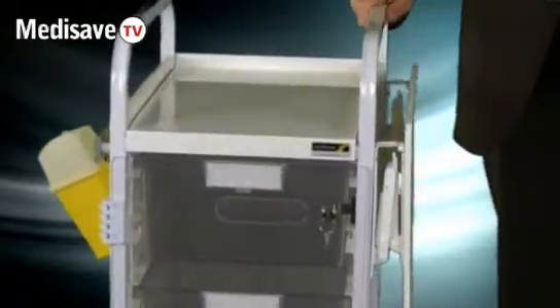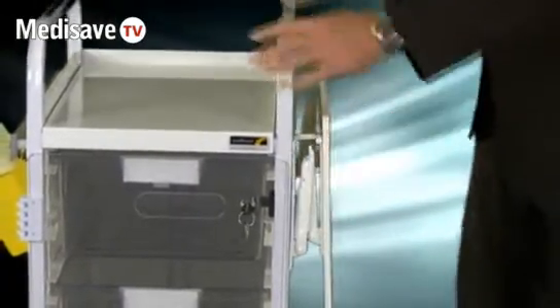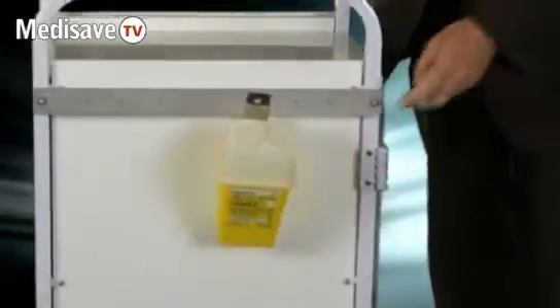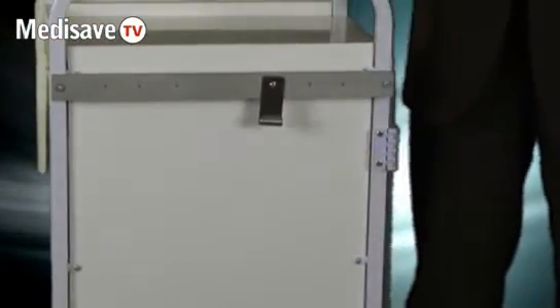This trolley is also fitted with an optional tilt-up shelf system, which releases as such, and also an optional medirail system, which allows you to hang a range of generic sharps bins on the side.